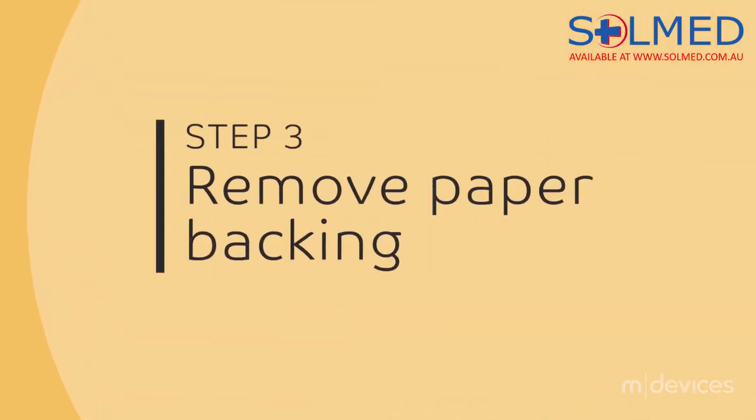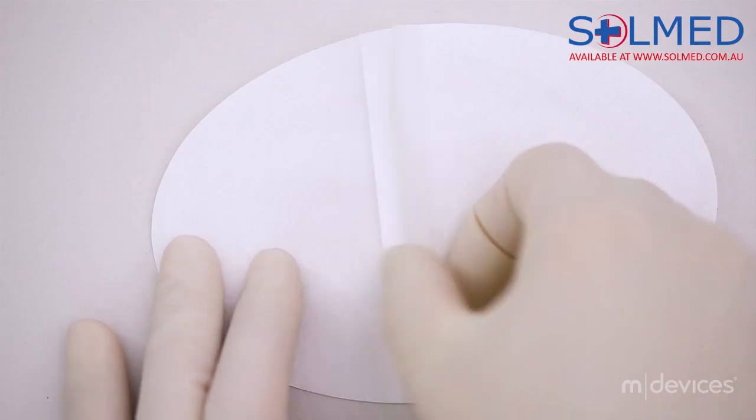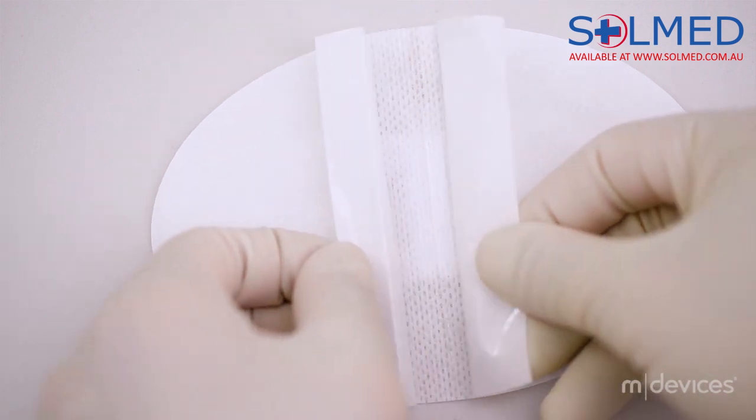Step 3: Using the two tabs of the paper backing, peel paper backing to expose the adhesive dressing.